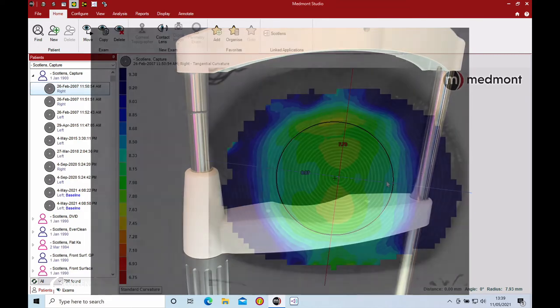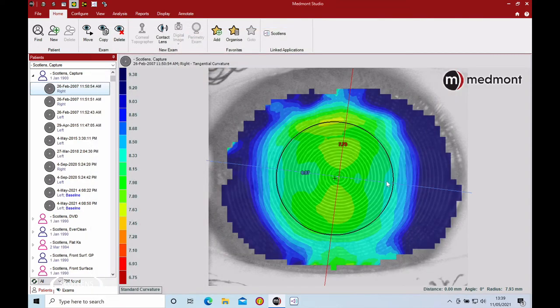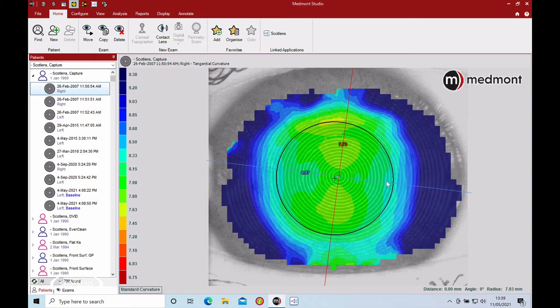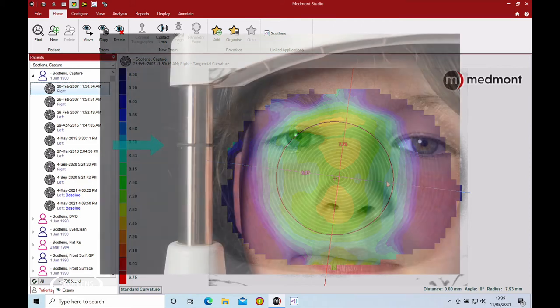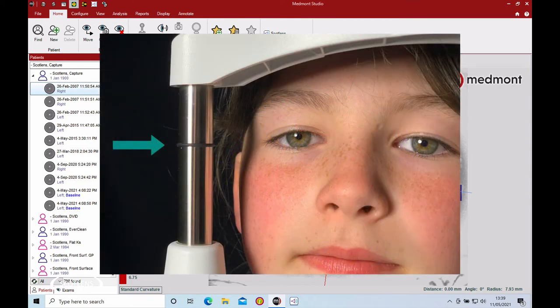Make sure the patient's at a comfortable height so they can get their head forward or back in the chin rest without straining. This helps get the lower lid or top lid out of the way.